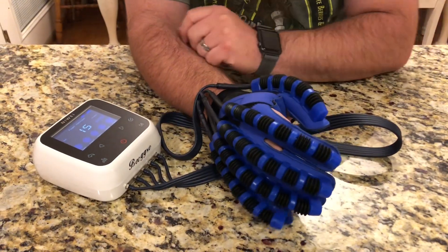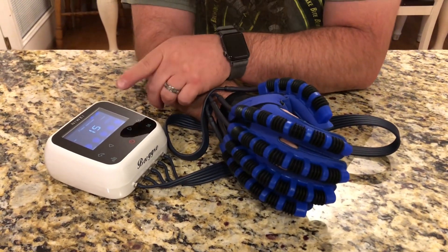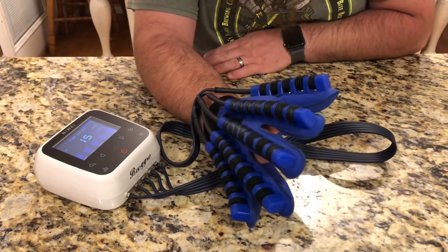The next mode is the finger exercises mode. You can adjust the speed on this one, but we're just gonna leave it as is and see what it does.